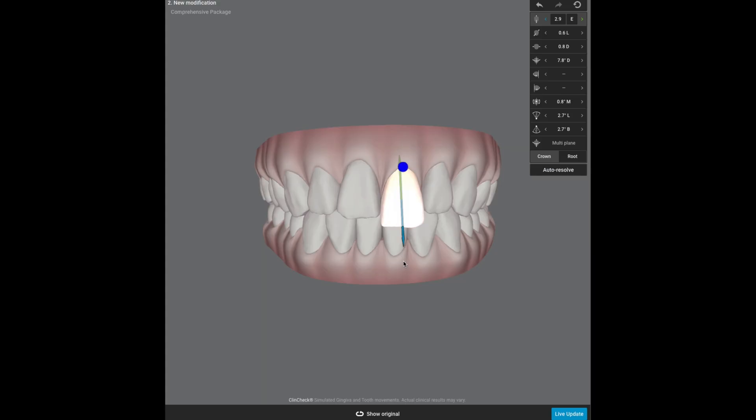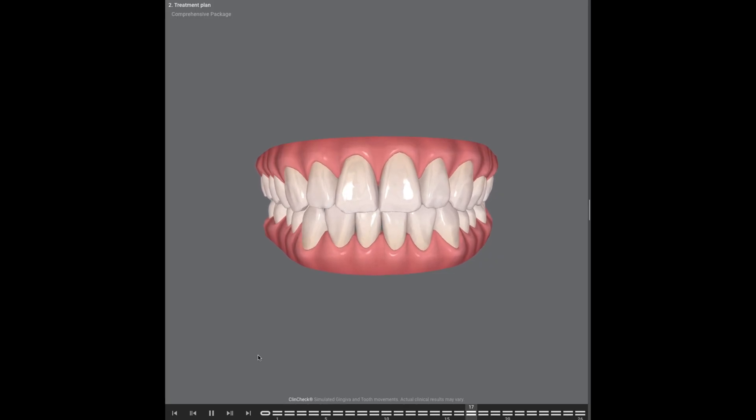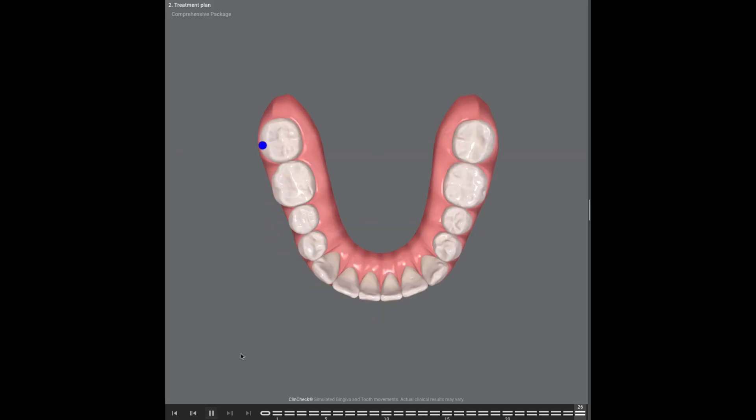Following that scan, the orthodontist is going to take it and transfer it into whichever digital software they use. I use mostly Invisalign, and once I get that scan into the Invisalign software, that's when I can start to have fun with it. I get to take the teeth, move them where I want them to go, and set the case up. Once I'm happy with the setup, I usually send my patients a video of that setup so they can see step-by-step how the teeth are going to move and where I want to finish them.